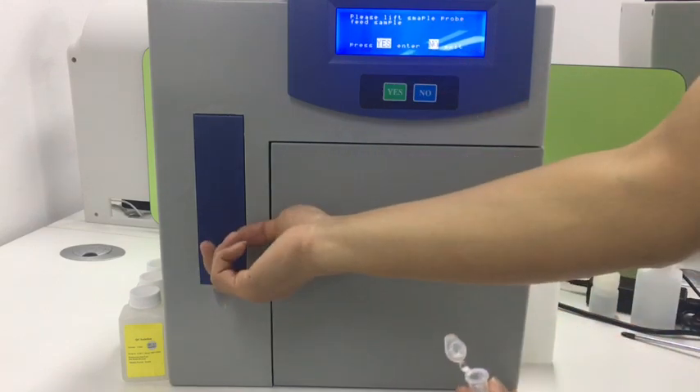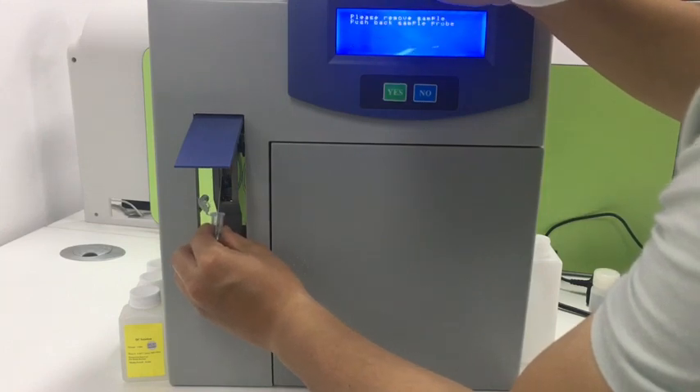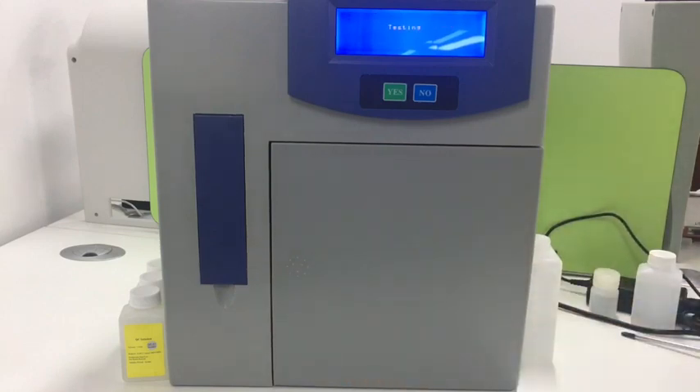For example, if we have several samples to test, this is the second one. We follow the same procedure, just wait for the result. Now it shows the second result.